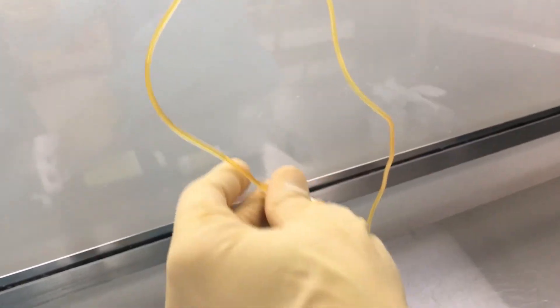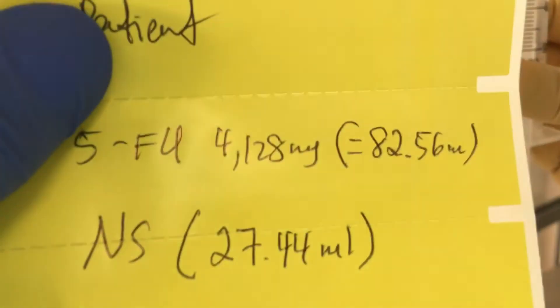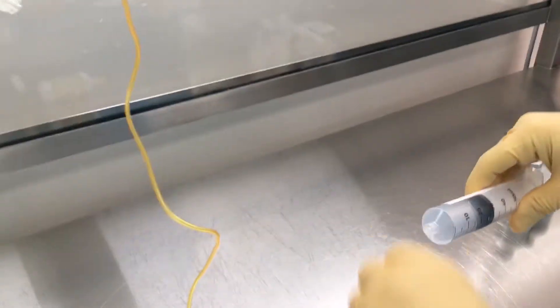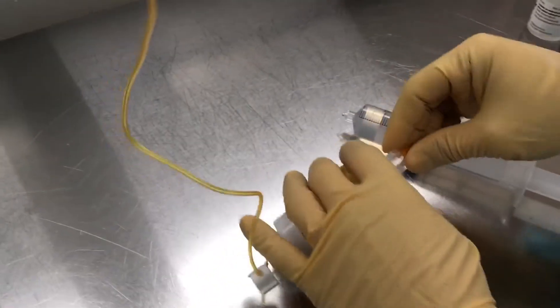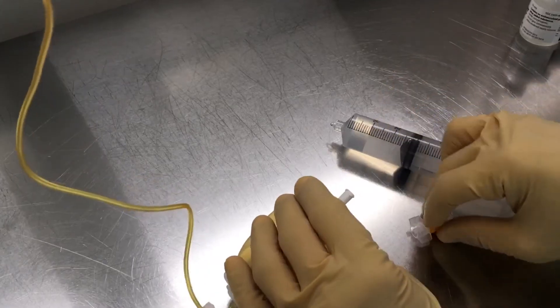Next, we're going to open this. We're going to draw up the volume of NS that was on the label: 27.44 ml. This whole volume is going to go inside the pump, and it will prime the tubing.